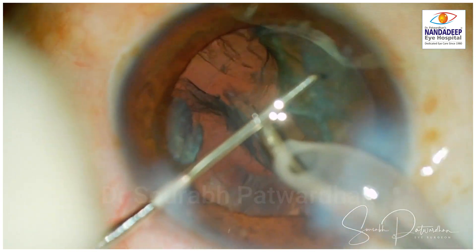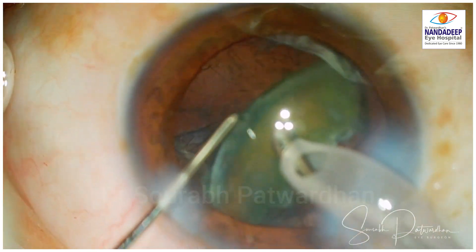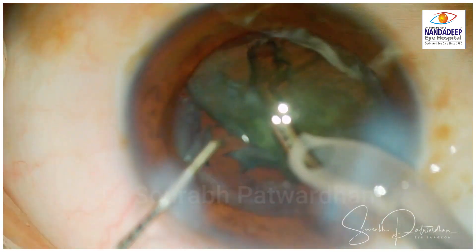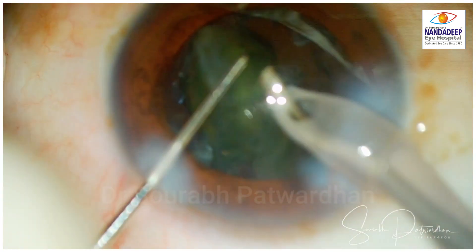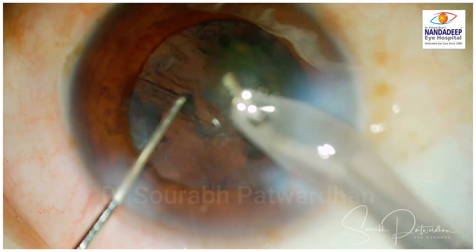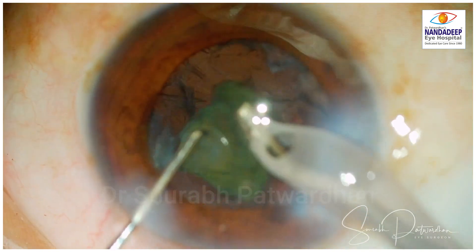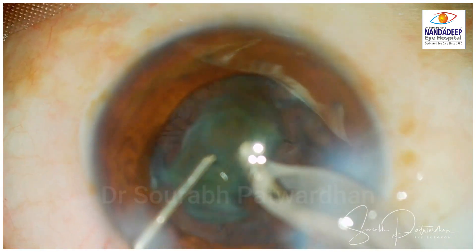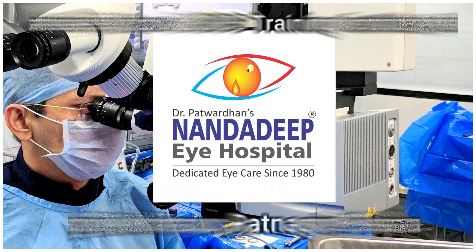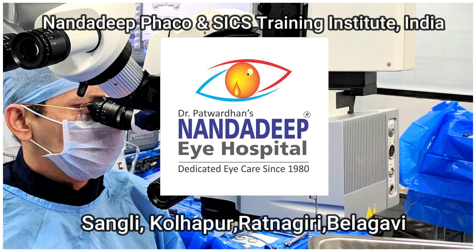Always remember when you see this kind of case, think about bowl formation — that is a likely possibility. Make sure that when you are doing trenching, you do it deep and try to get a split quadrant. At least one quadrant should be properly split from the others, otherwise you can go back to hydro prolapse. Have a good size rhexis before you begin.